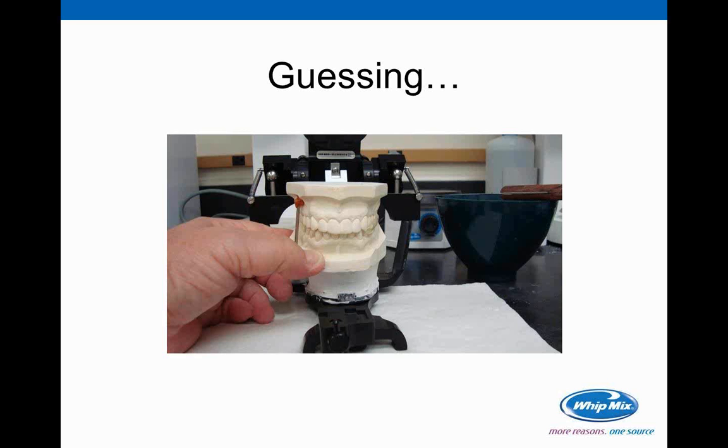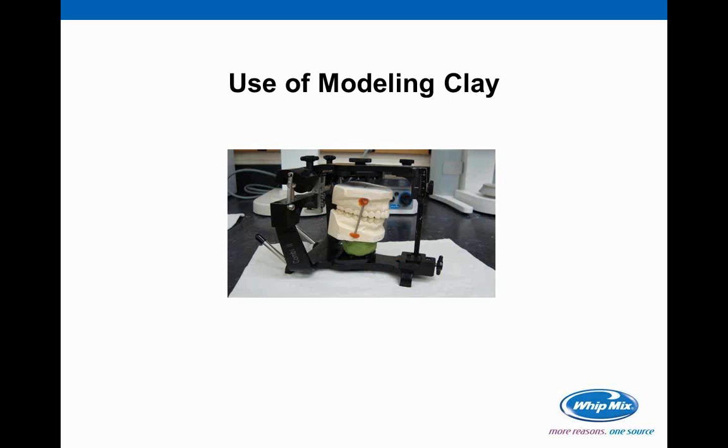This is done more and more, and if we succeed with not too many negative responses from the doctor, then we feel that we've done an excellent job. And we continue to do it approximately the same way to the point where we feel like we're successful in what we're doing. The reality is that we're only marginally successful at what we're doing when we're guessing.